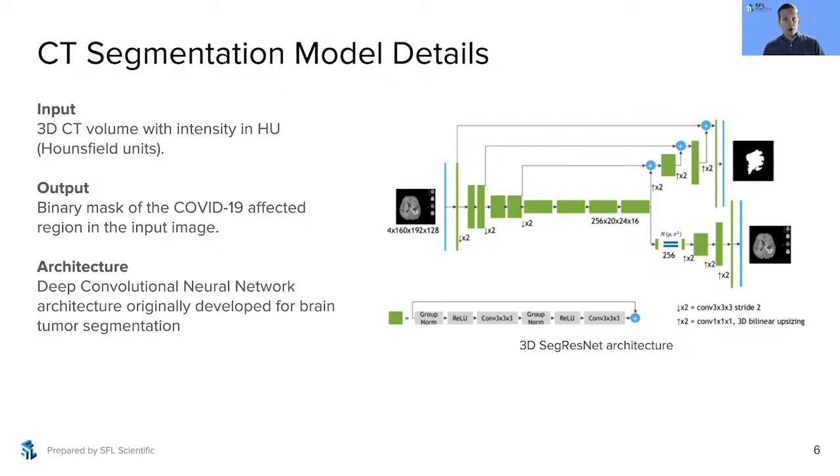Some quick background on CNNs. A convolutional neural network is a class of deep neural networks that employ a mathematical operation called a convolution. This operation allows the model to effectively scan small areas and keep track of local spatial relationships that are key to understanding and processing 2D and 3D image data. A CNN makes successive mapping operations to transform pixel inputs into high-level features, and various CNN-based architectures are used in medical imaging-related AI systems. These types of networks are trained by learning from examples, and they demonstrate state-of-the-art segmentation accuracy both in 2D and in 3D medical image modalities.